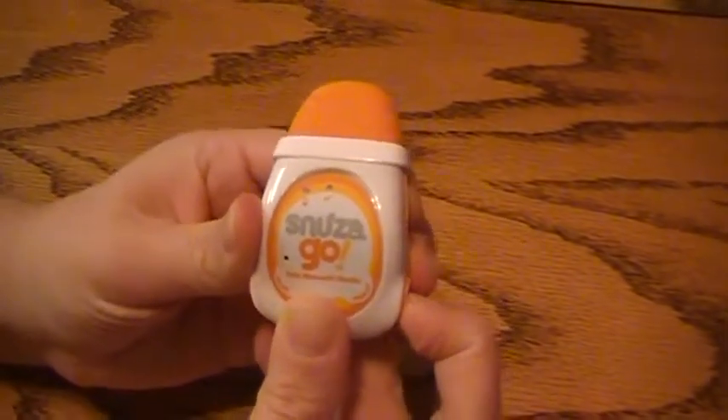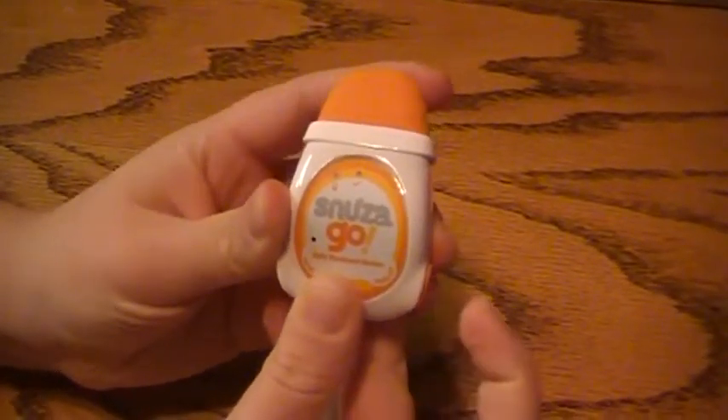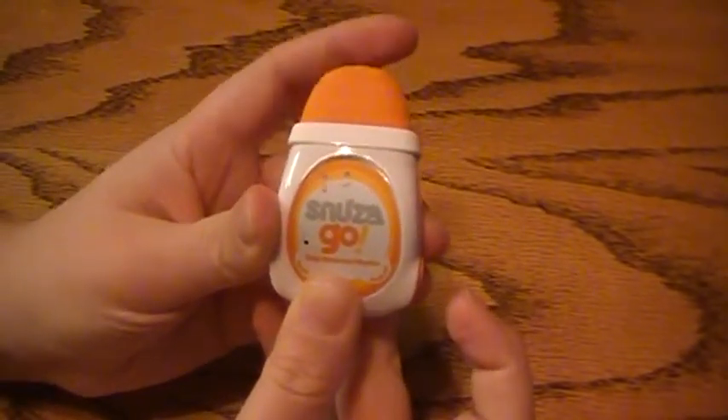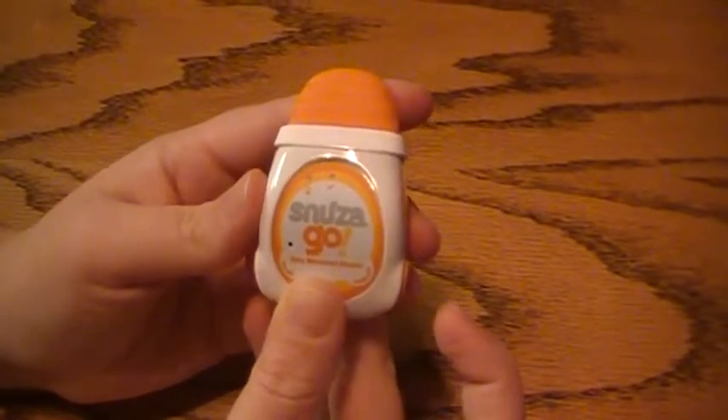To make it progressively louder, you push the button again, and it has three different settings. That's the loudest. And then on the fourth push, it goes back to silent. And that is how you program the Audible Tick function on your Snuza Go.